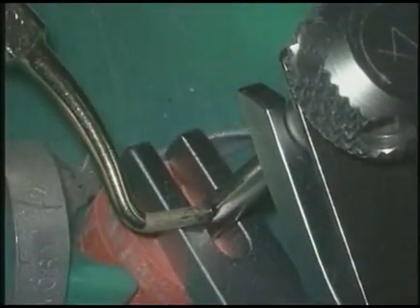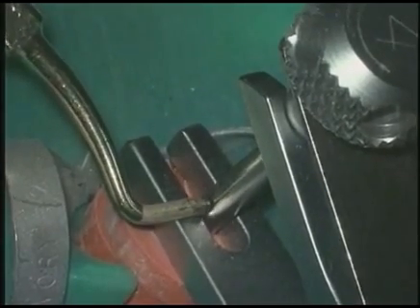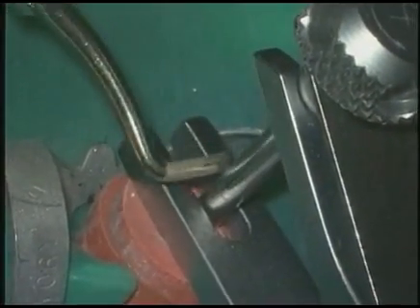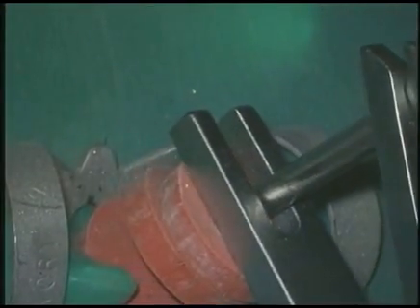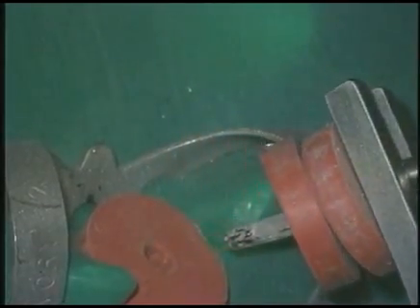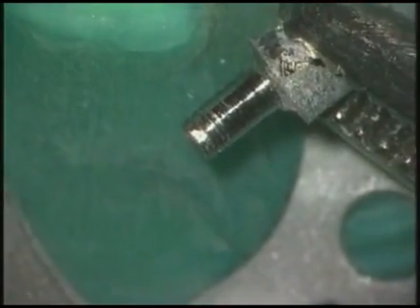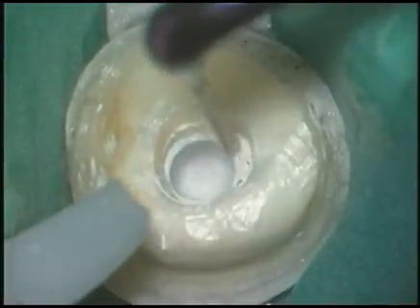If the handle ceases to turn easily, then we employ ultrasonics, as has been previously described. And ultrasonic energy will pass through the tube, down into the post, and begin to generate cement bond failure. Progress with ultrasonics until the mandrel and apparatus frees up and elevates the post from the root canal system. It's useful sometimes to see the power of the system. With the liberated post, you can see that just 2 or 3 threads are sometimes all that stands between success and failure.